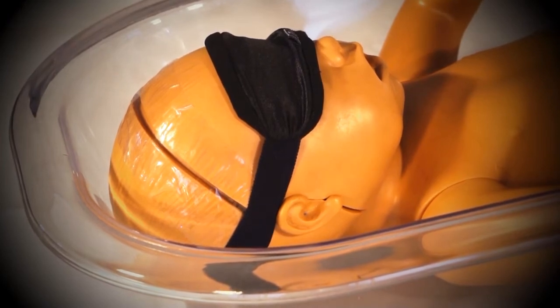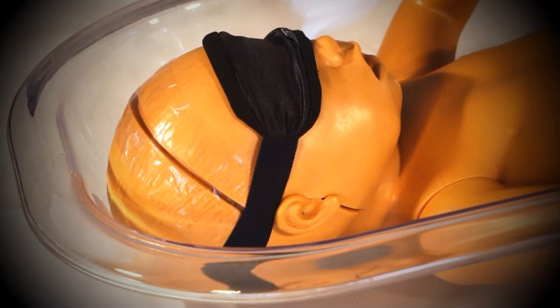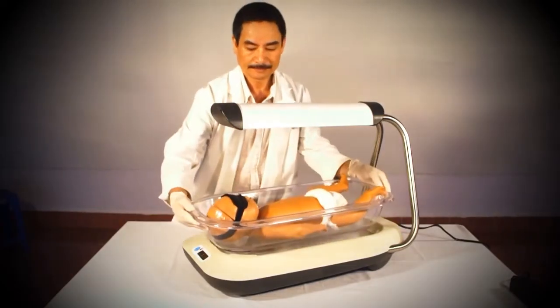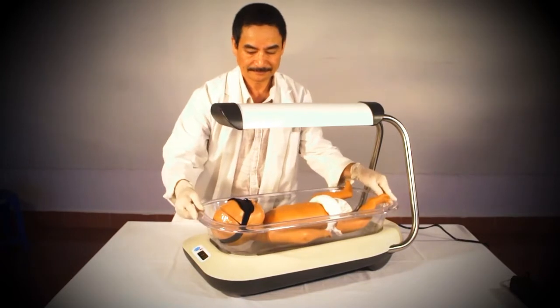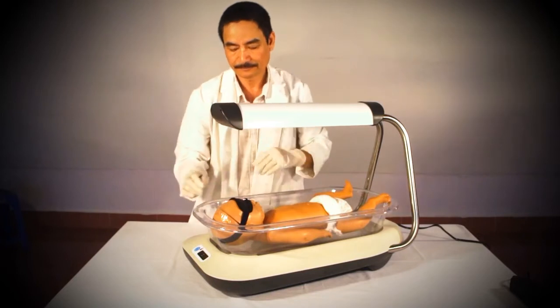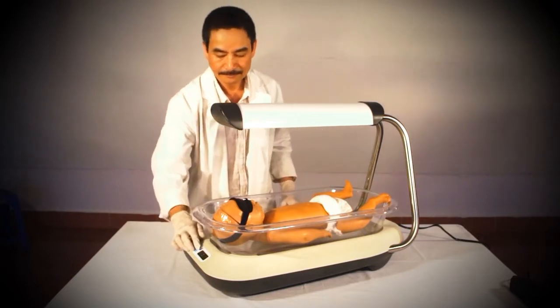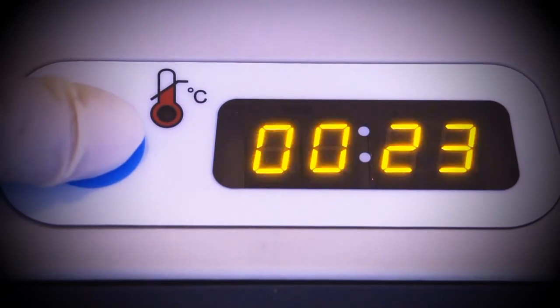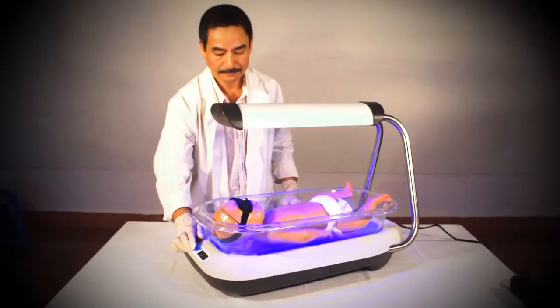The baby is now ready for phototherapy. To initiate treatment, place the bassinet back onto the unit. Make sure that the bassinet is securely in place and that the baby's eyes are still well covered. Turn the Firefly on by pressing the blue power button on the front of the main unit. The baby is now receiving intensive double-sided phototherapy.